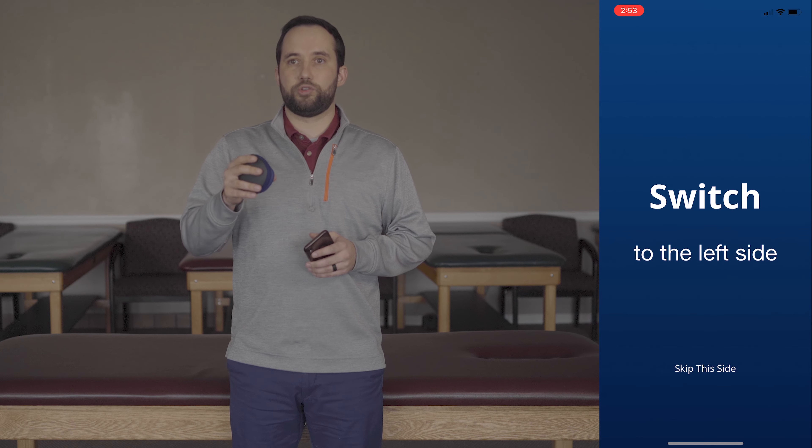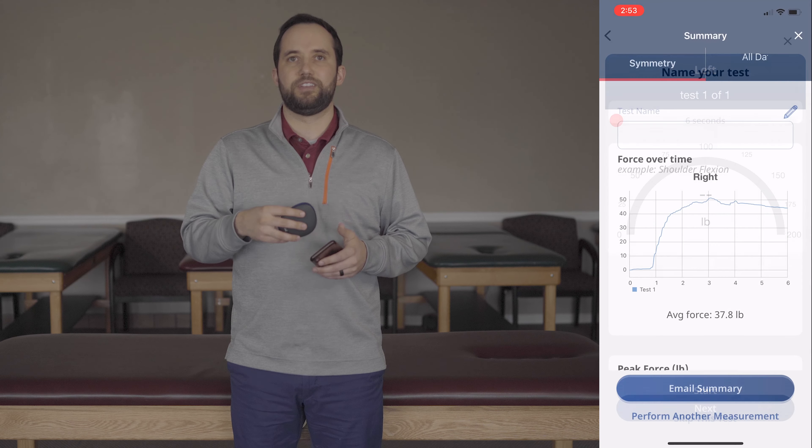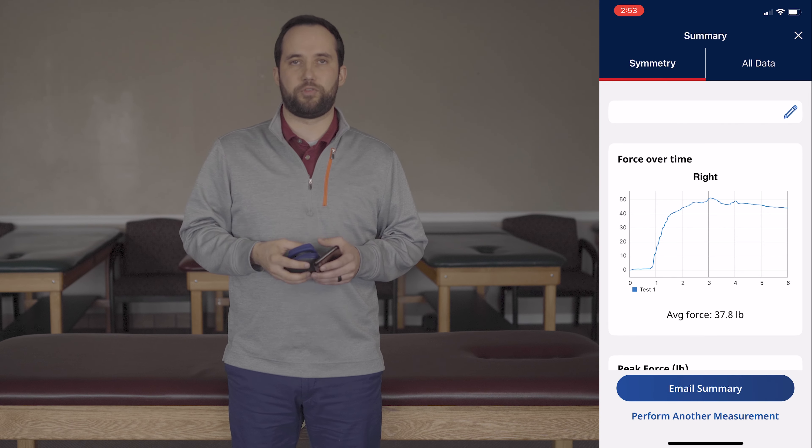At this point you'll be able to choose if you want to do the next side or if you want to redo the test. You'll perform the test on the other side, and at that point you can email the summary to yourself or you can perform the measurement again.